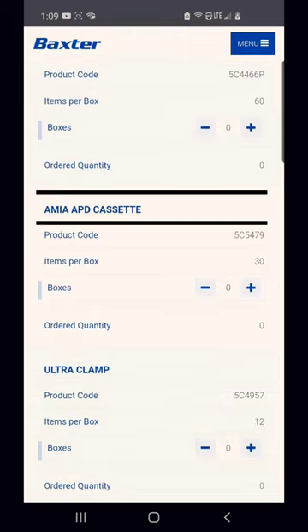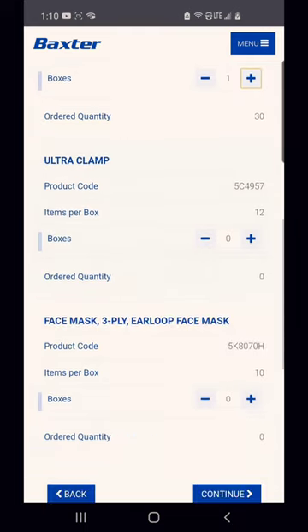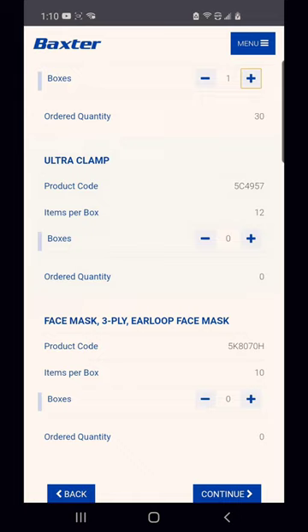And then the Amia PD cassette, I think with that, you're always going to need to add one. The only reason you're not going to add one is if you currently have two boxes as you're ordering. So ultra clamps are the red clamps that you use when you're doing manuals. It's always good to have a good amount of these because you do have to wash them every time you use them. So I currently have a box of them just in case, because I know I don't do manuals, but sometimes it's necessary to use the clamps for certain dialysis needs.